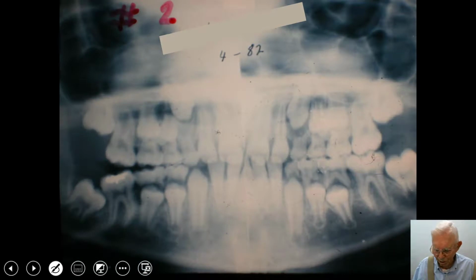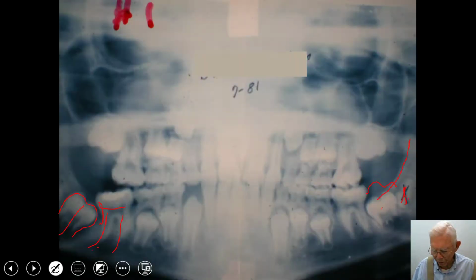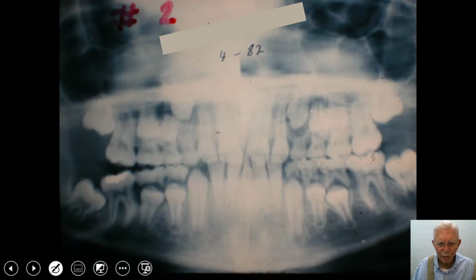Now, let's go to the next picture. The first one was in 1981. I didn't see him again until the fourth month of 82. And this tooth is getting worse. This angle is setting down. I thought maybe it would turn up, but it doesn't. And this one over on this side, actually, if we got the wisdom tooth out, it is beginning to come in correct. We have other problems up here, crowding and getting the teeth down in place.